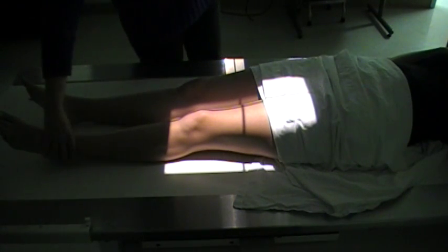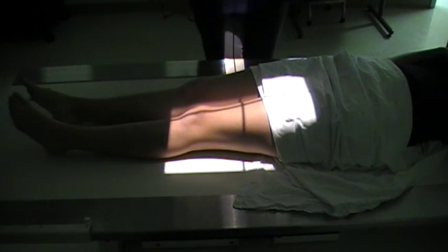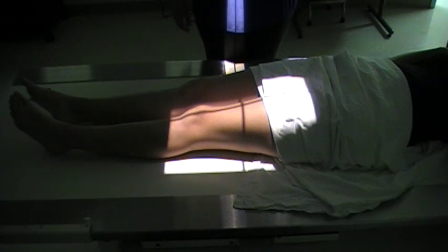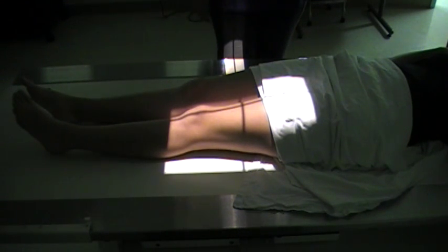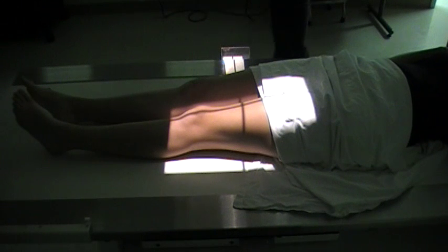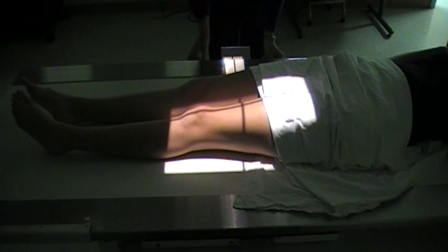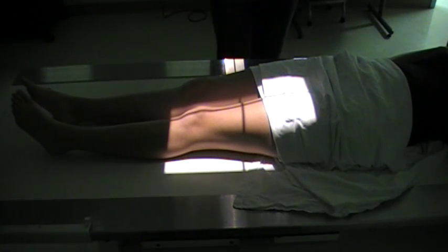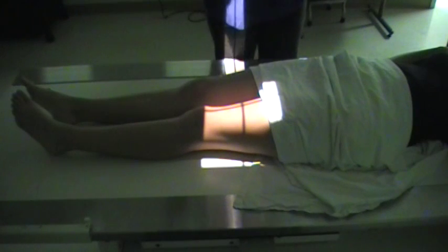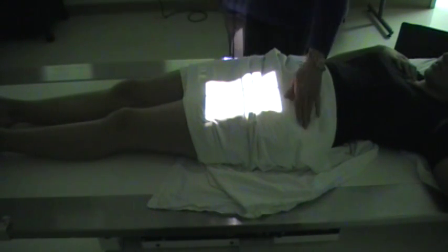Okay, now I'm going to rotate the leg inward. Okay, and this will be our AP femur to include the distal femur. Okay, now we'll change out the IR and put in a 10 by 12. Okay, and now we will get the proximal portion of the femur.